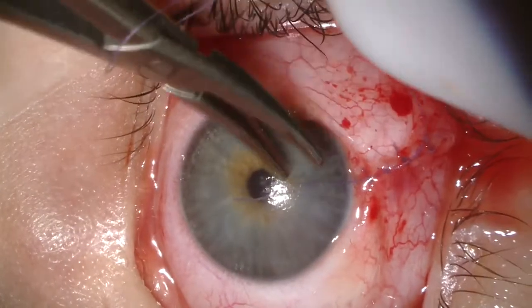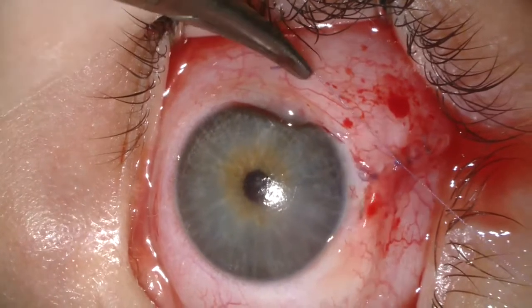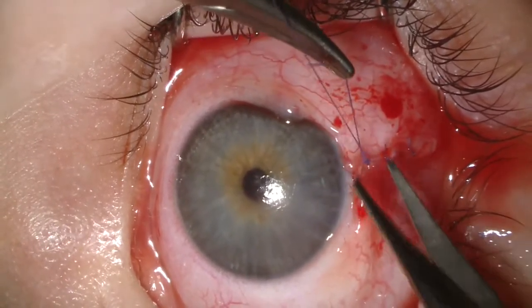We place fibrin glue over the stitches and the patient wears a pressure dressing for two days. This concludes the surgical management of conjunctival nevus.